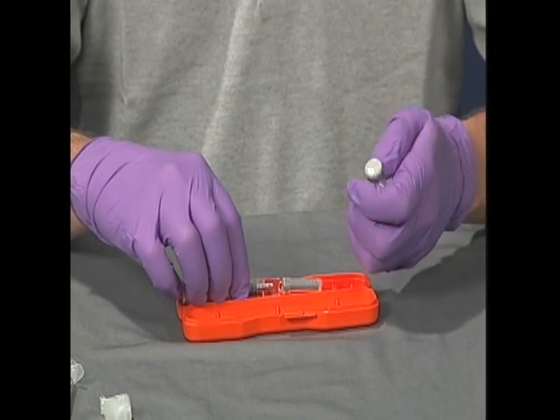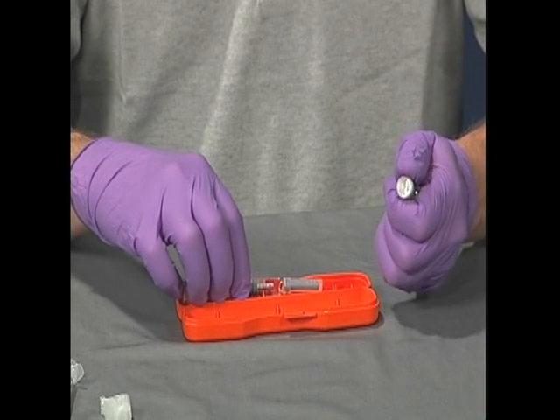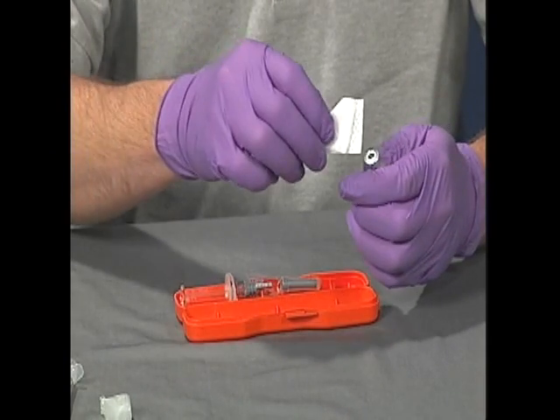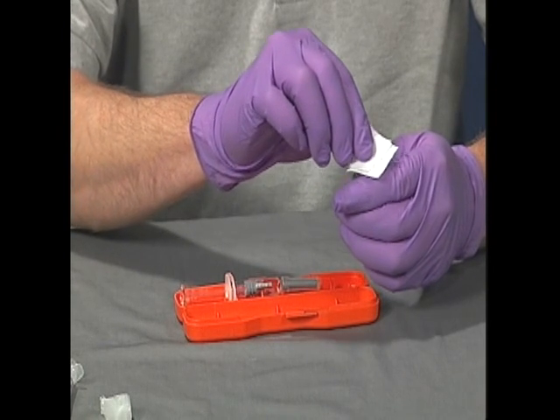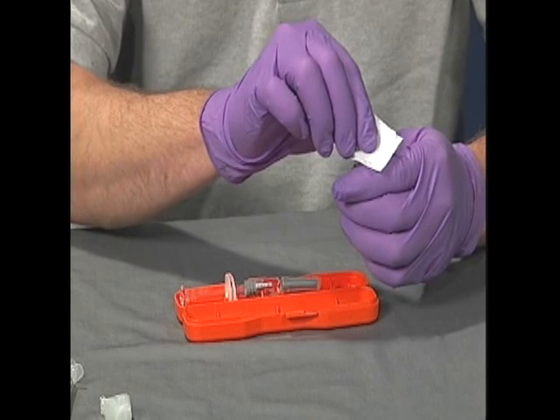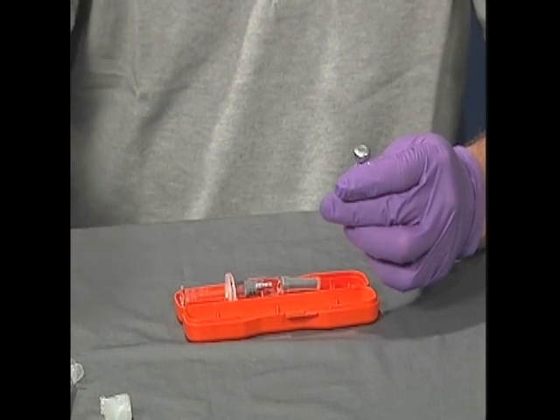Remove the protective flip-off cap from the top of the vial and wipe the rubber stopper with an alcohol prep or another suitable antiseptic swab. If at any time the rubber stopper becomes contaminated, you will have to repeat this procedure.